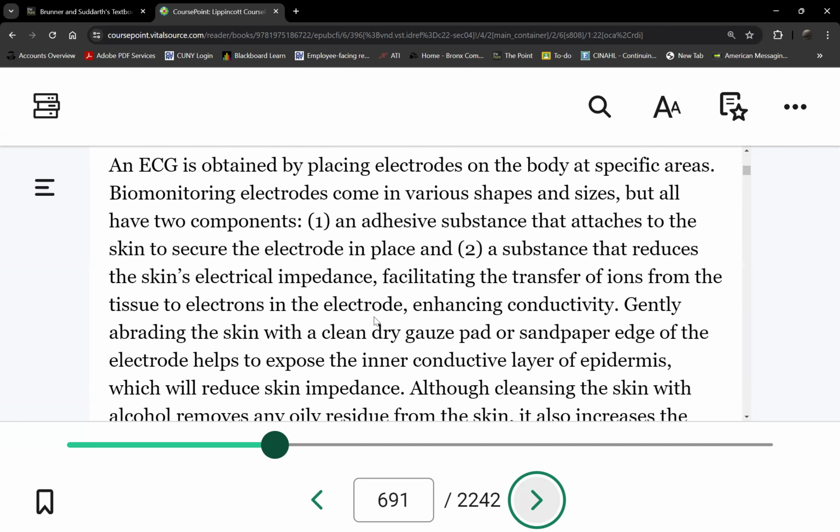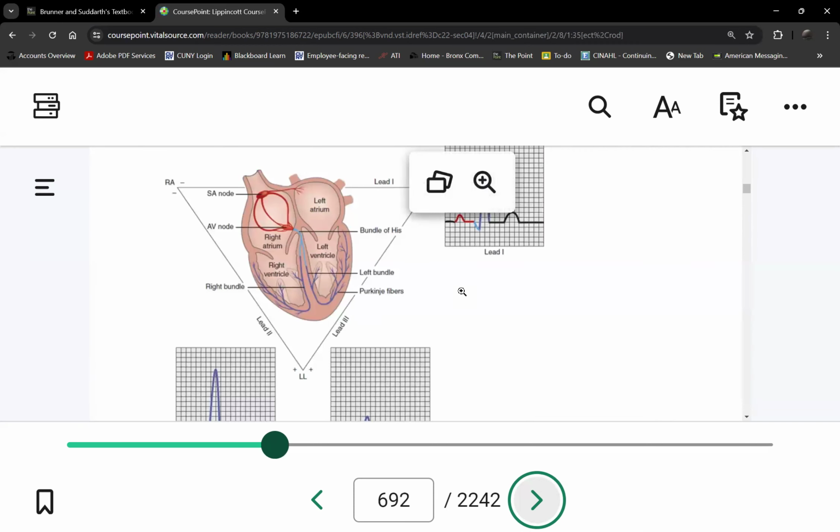He postulated that you can capture the electrical activity by placing certain electrodes, some of them unipolar, some bipolar. I won't discuss this part because it's a long story; I don't have time to discuss how an ECG actually works. But let me just show you the same figure as we did earlier. So let's look at the figure.